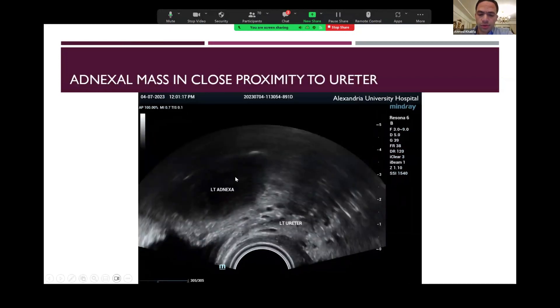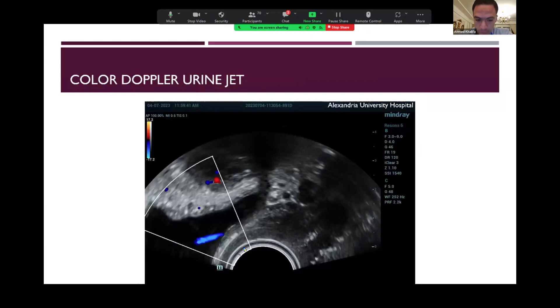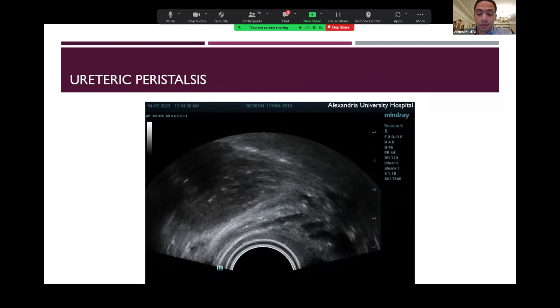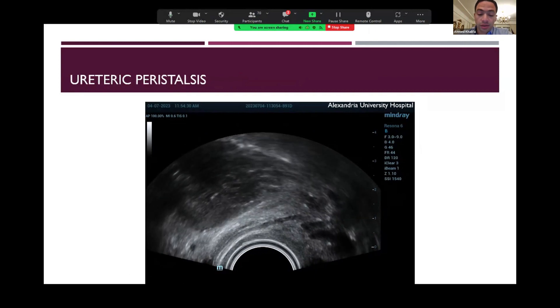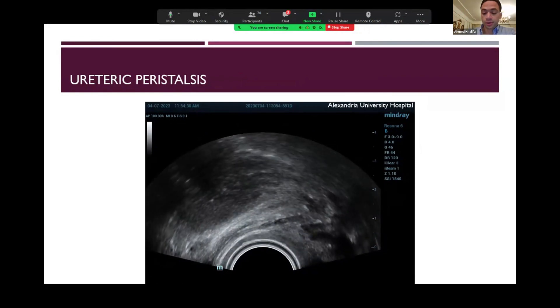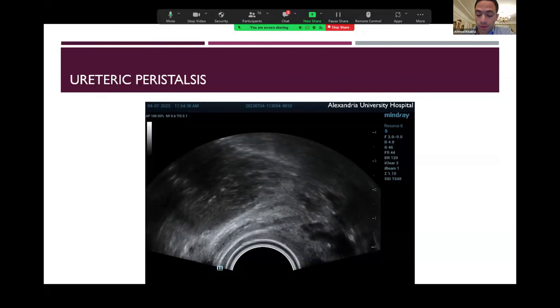The ureter is very important to check in these patients because sometimes it can be in very close proximity to certain adnexal masses. For example, this is a left adnexal mass, most probably a left endometrioma, and the ureter is slightly below, very close to the adnexia. This is a huge endometrioma almost flush with the ureter — very important to note during dissection to decrease the incidence of ureteric injury. If you are in doubt that a structure is the ureter, you can wait one to two minutes to check ureteric peristalsis, which will confirm it, and then track the ureter to the great vessels, checking the entire pelvic ureter for any deep endometriotic lesions, hydronephrosis, or hydroureter.